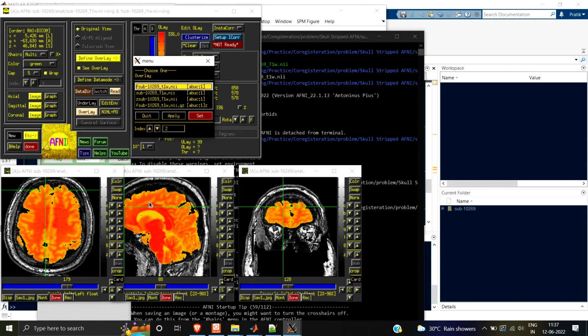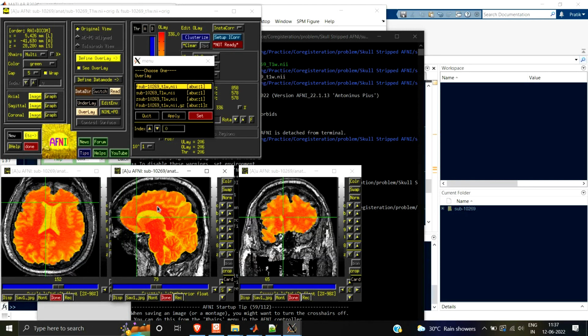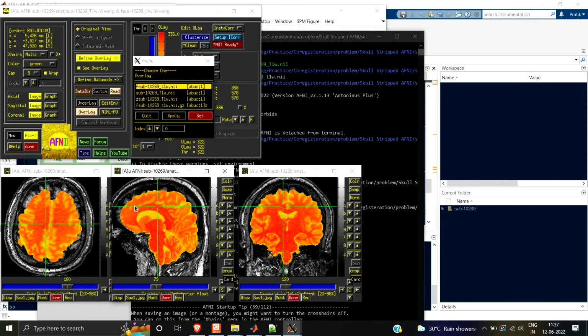On the other hand, FSL is not that accurate, but still it will give you an okayish kind of result. You can see over here, there is no AFNI, I mean, FSL brain. So that is the difference between AFNI and FSL brain extractions. FSL also does a pretty good job, but AFNI is a little better. But AFNI takes a lot of time. So that is the trade-off between the two.